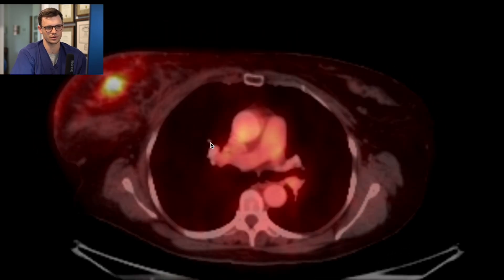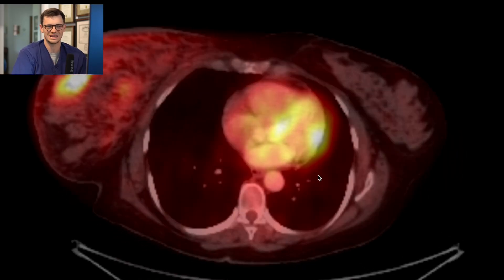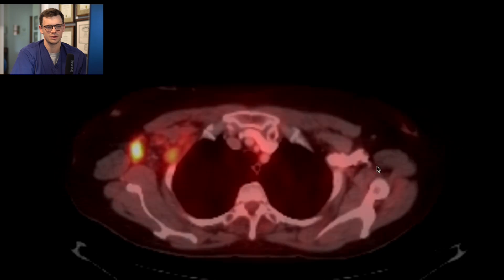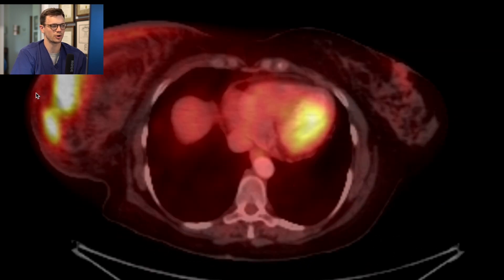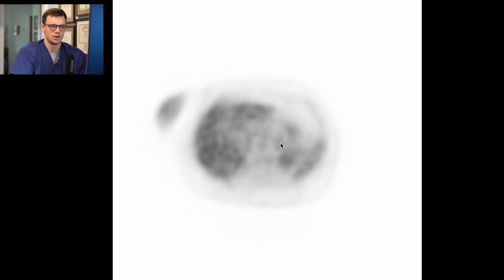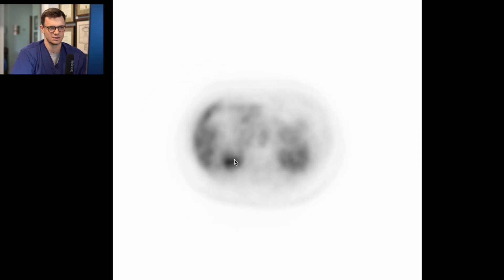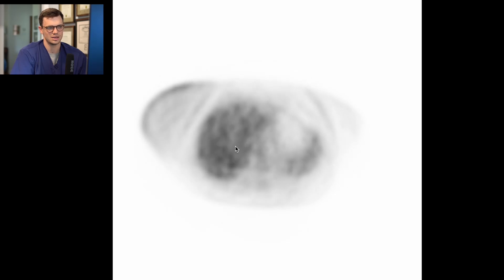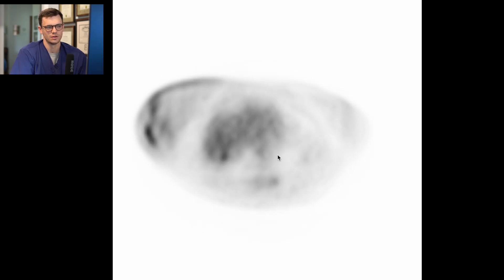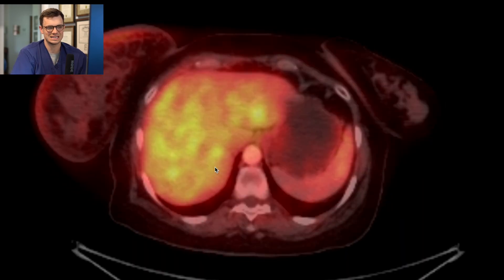I'd want to then look at the lungs — breast cancer can go to the lungs. I don't see anything definite beyond background in the lungs, and I don't see any other nodes. We'll do the bones at the end. Going down to the abdomen — I like to do the PET images and start at the liver. The liver can be heterogeneous, but look at this: in the posterior right hepatic lobe, this focal hot spot I'm pretty confident is a metastasis. I think there's another one that caught my eye — this here could be a met. And then something in the left hepatic lobe that could be a met too. These PET images allow you to look at the liver a little bit better. I then go back to the fused CT images.